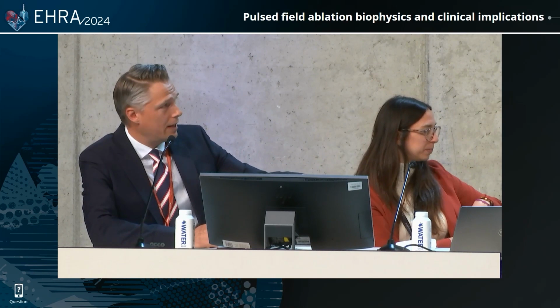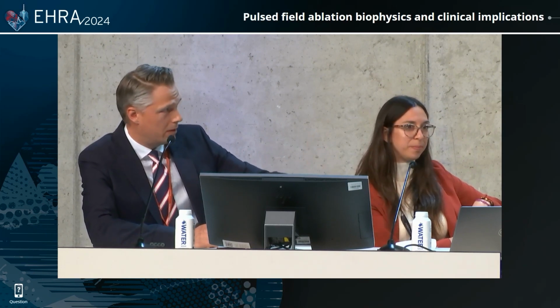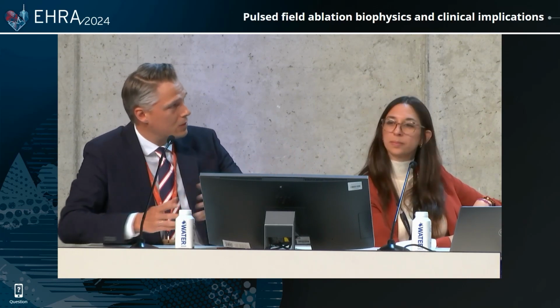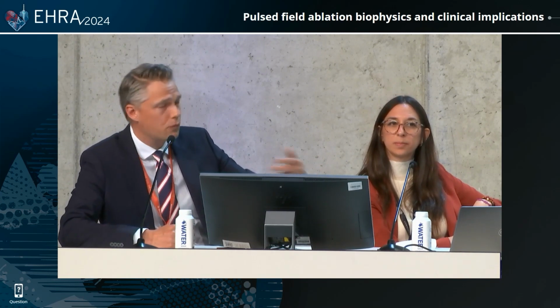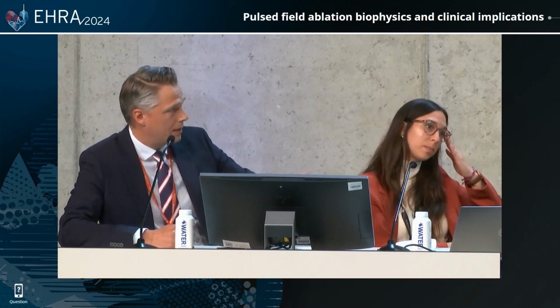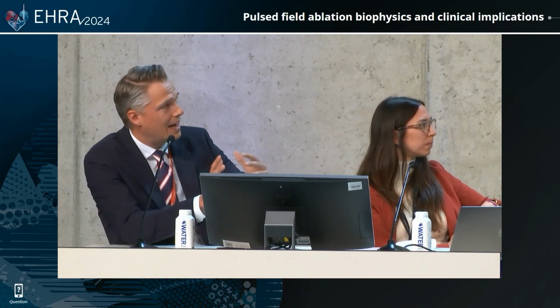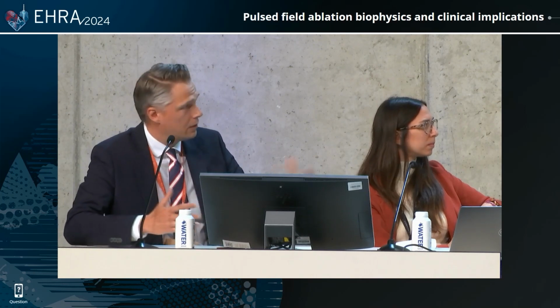When we look at the PFA data, we see an early effect in terms of edema, so there is some inflammatory effect or whatever, but then the late enhancement disappears over time. The veins are still isolated, but it seems like we see a different lesion formation pattern. Is that what we see, maybe an effect of the thermal side effect, and this disappears, and then we have scar formation? Or is it a completely different approach?